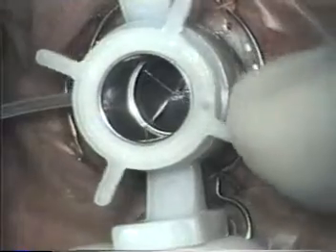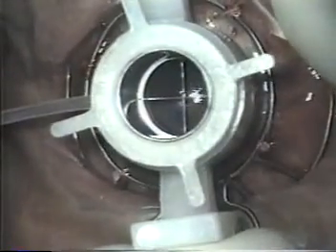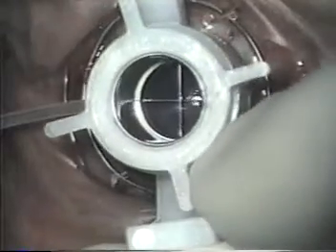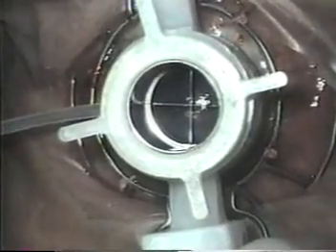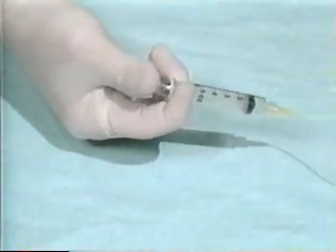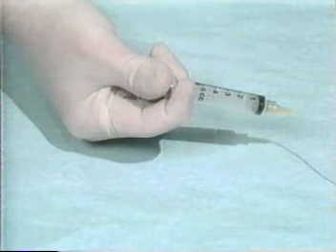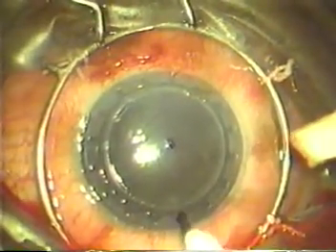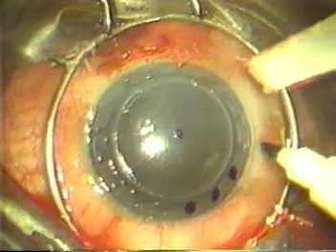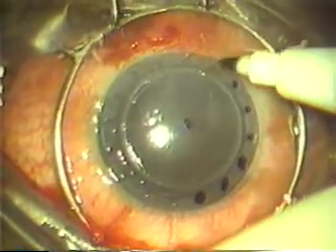The trephine is pressed evenly on the corneal surface and the plunger is released abruptly to create a vacuum. The trephine is stabilized by gently holding the struts and the cornea is cut by turning the spokes clockwise. The initial three spokes turned lower the blade to the zero position. The number of spokes to turn further depends on the desired depth of cut and the corneal thickness. It is recommended that the cornea be cut as close to Descemet's membrane as possible. After the cut has been made, the trephine is removed by pushing the plunger in all the way to release the vacuum. The anterior surface of the recipient cornea is then dried to reveal the 16 radial impressions, and each impression is marked with a surgical marking pin containing gentian violet ink.